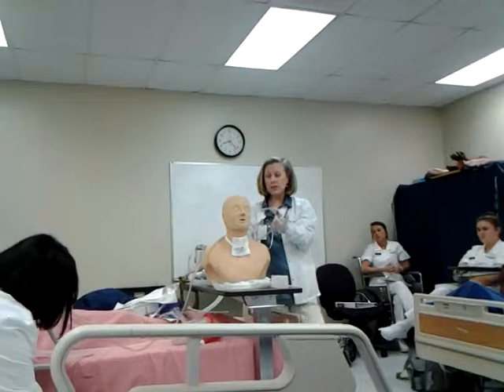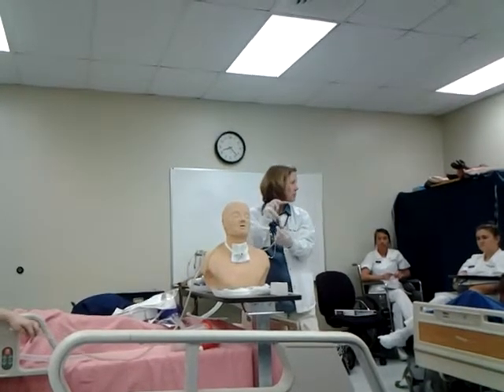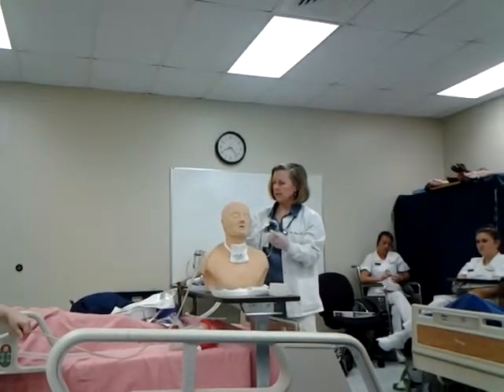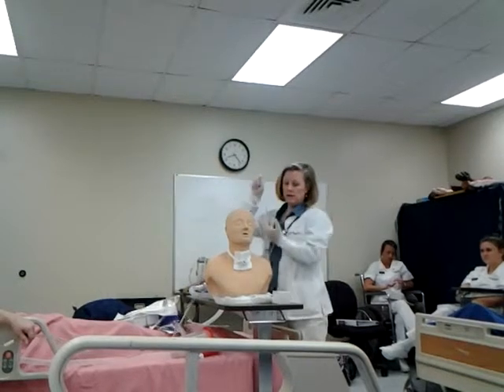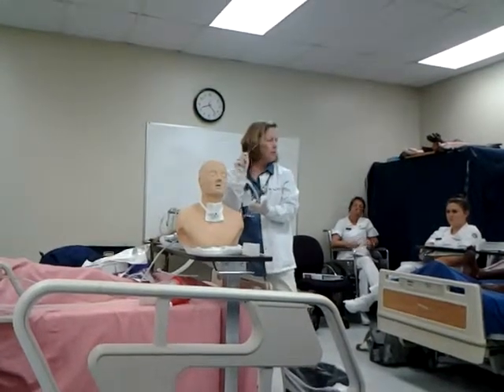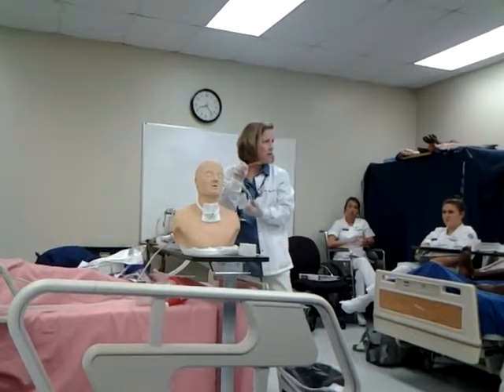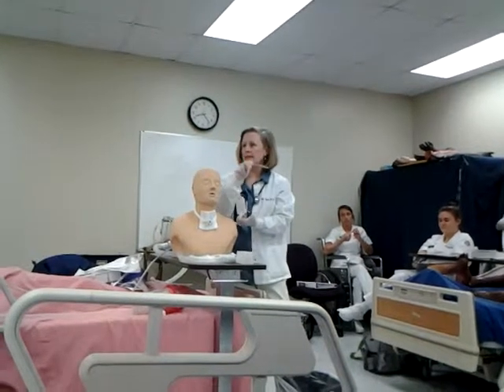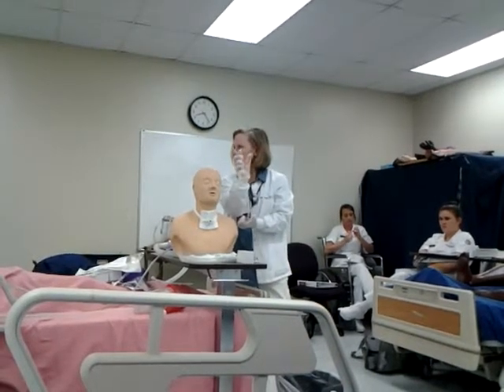And when you suction a patient, and your book will tell you this, you never suction going down the patient. We measure from the nose to the earlobe. That's about how long we're going to go in. And when you go in, you're not going to apply any pressure. But to make sure that my suction is working, does anybody remember what level of suctioning we put our whole wall unit on? 80 to 120. Very good. 80 to 120. All right? And that's medium. Usually your wall units are color-coded green, yellow, and red. So it'd be right in that middle section, 80 to 120.